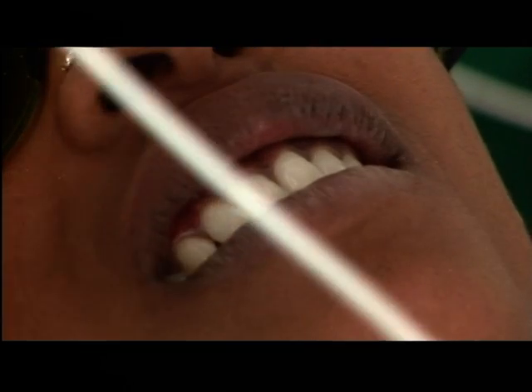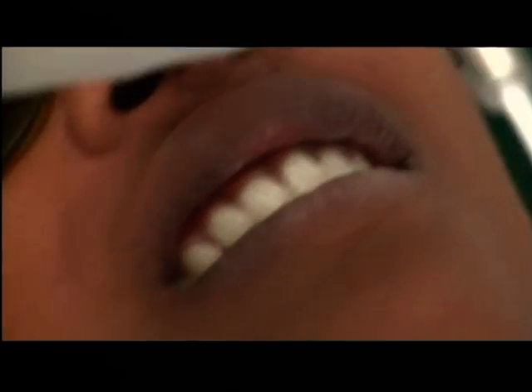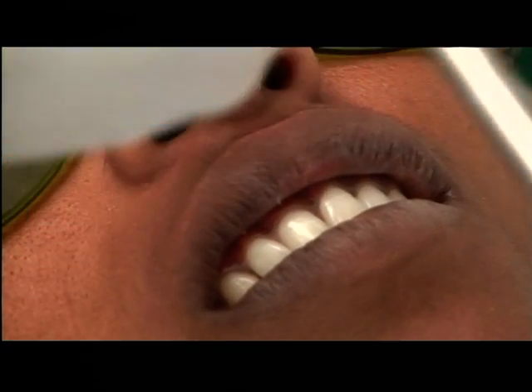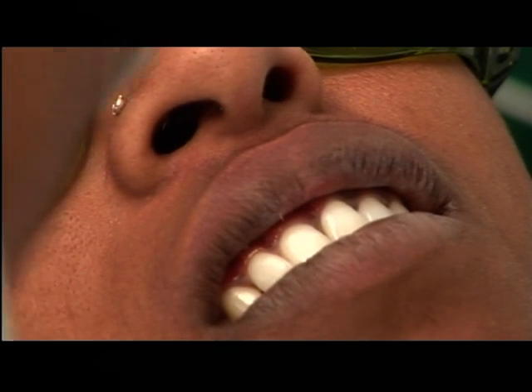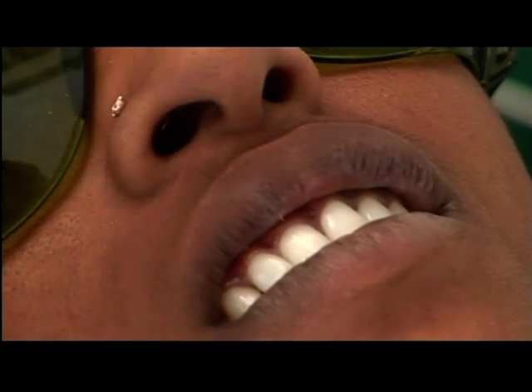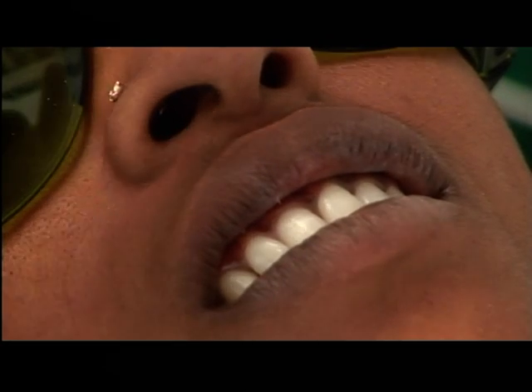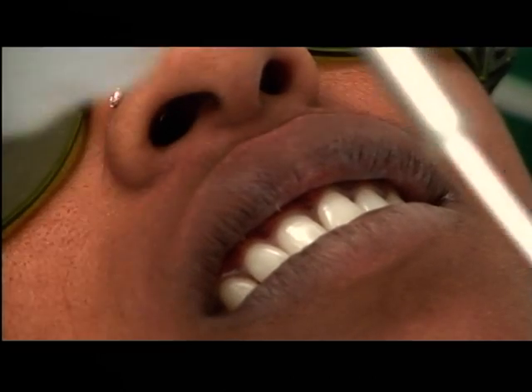The spot size from the fiber — it's 320 microns as a tip, that itself is the diameter. When using other lasers like Erbium YAG or dermatological handpieces, where a larger area needs to be covered on the skin, you choose a spot size of 2 millimeters, 5 millimeters, or whatever. Here, whatever the fiber diameter is will be your spot size.